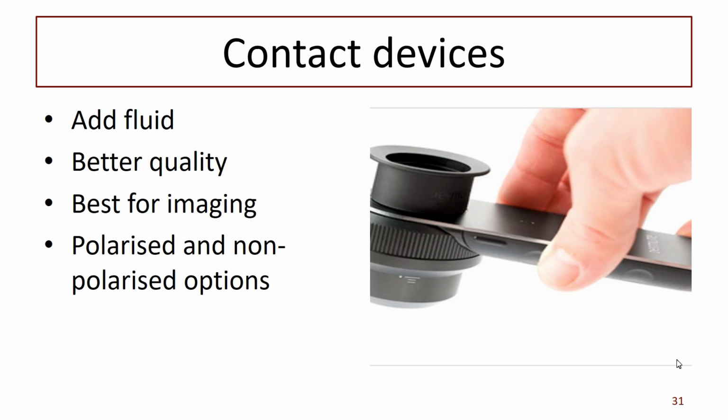If you've got a contact device, that means that the device must be in contact with the lesion that you're examining. And in order to see what you need to see for dermoscopy, you must apply fluid. So you remember with microscopy in the old days in medical school, you're looking down these two holes and wondering what on earth you were supposed to be looking at. When you went to the ×100 magnification, you had to have oil immersion. And that is true for contact dermoscopy. It doesn't need to be oil, it can be alcohol, which is much more convenient, but it's a pain in the neck.